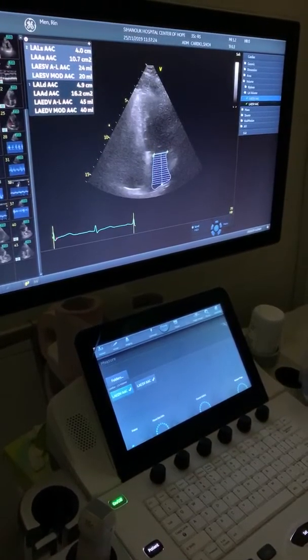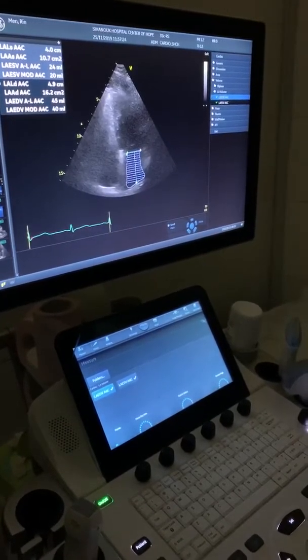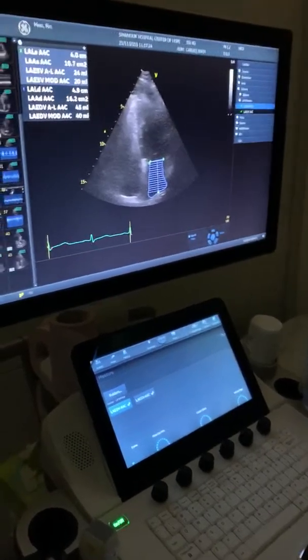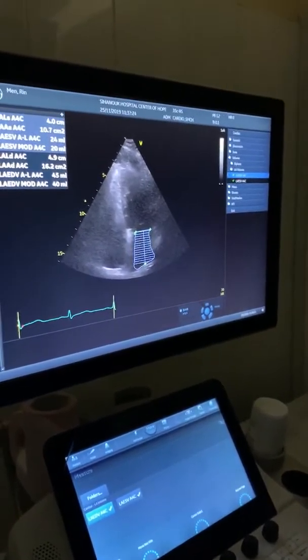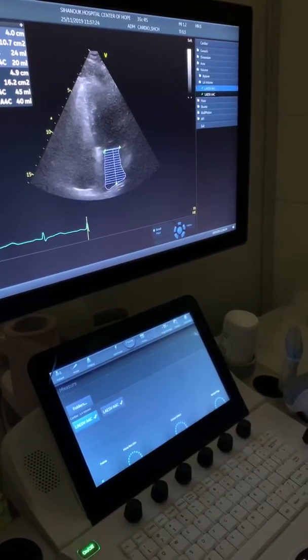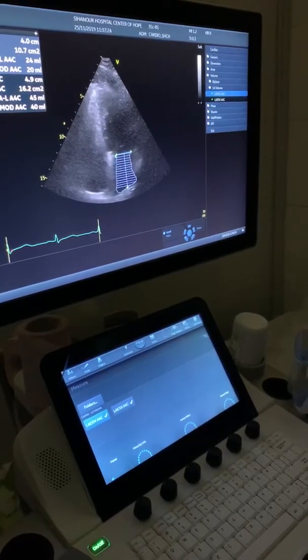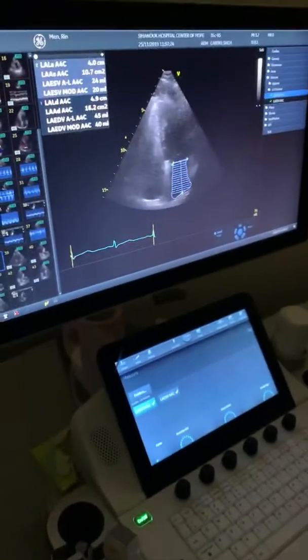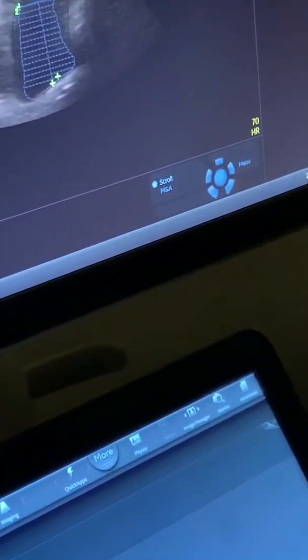I think I did not see it correctly. Somewhere here, right? You see that? So it's 40-45 total. I did not remember the volume. The normal is from there to there. We'll Google it. Okay. That is the left atrium volume. I think that is more accurate.